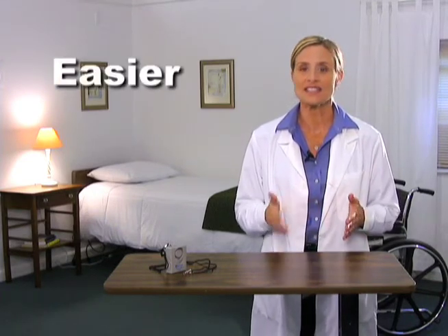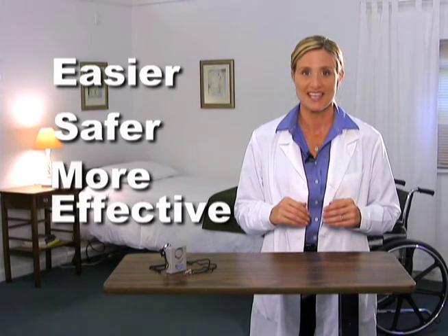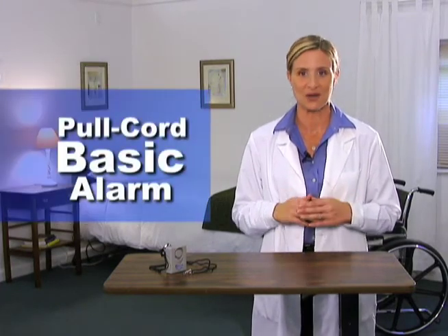Hello, I'm Heidi Young, a member of Alimed's customer outreach team. As a member of that team, I visit many healthcare facilities and we've really listened to what you have to say. Alimed wants to make your job easier, safer, and more effective. This is why we developed the pull cord basic alarm.